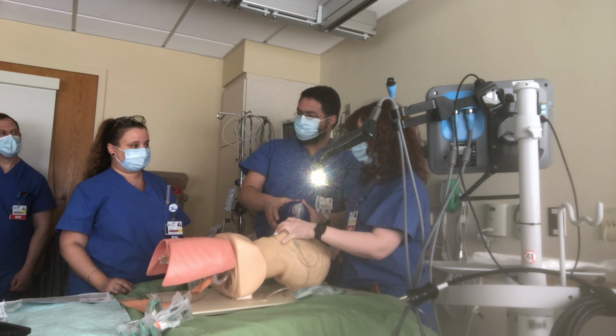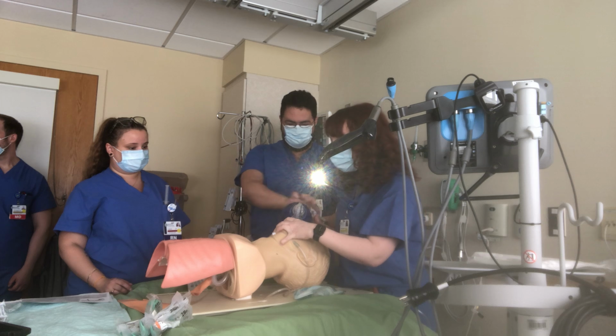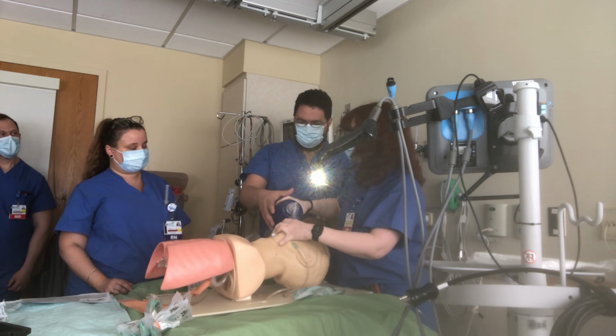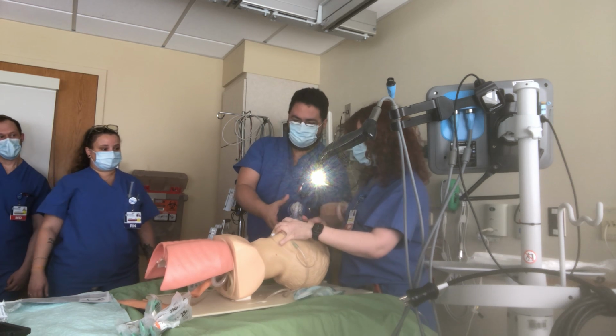Right, Professor Bertucci? You're not touching the soft tissue underneath. You want to put it on the mandible. Right, you're moving along. Beautiful. Then half a squeeze. So let's say I'm doing this.